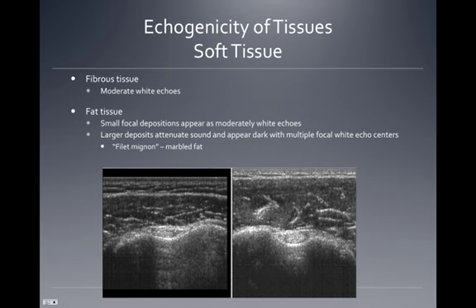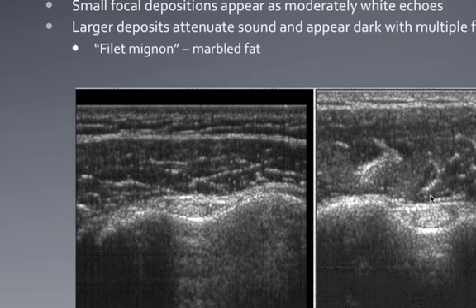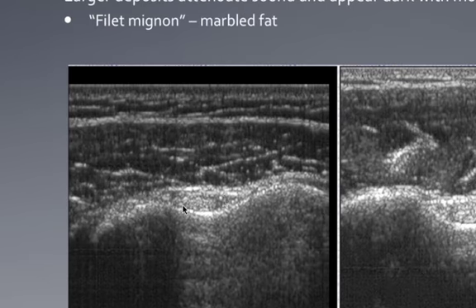All right, same picture though, and if we look at the fibrous part here, we're looking at a cross-sectional image of the biceps tendon, and kind of a preview. This is what's called a transverse view. A transverse view is a slice or cross-sectional sort of view. And then above it, in the same picture, we're seeing muscle.